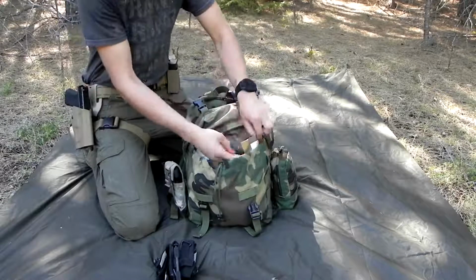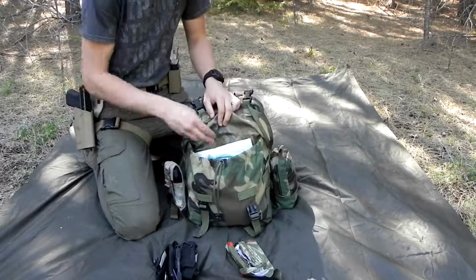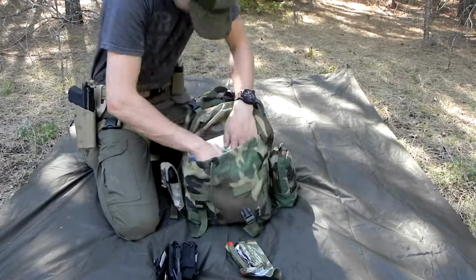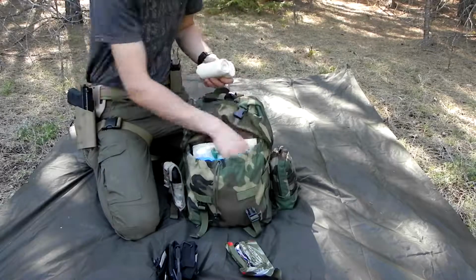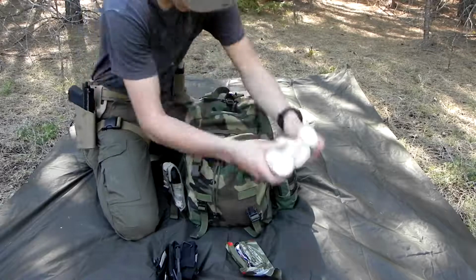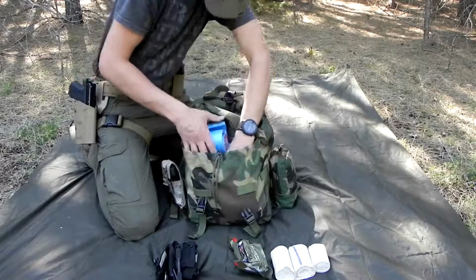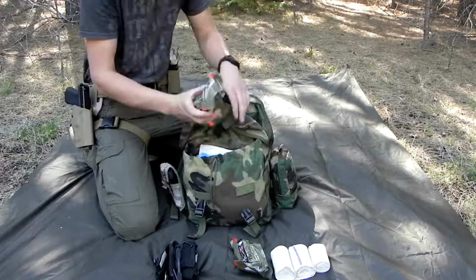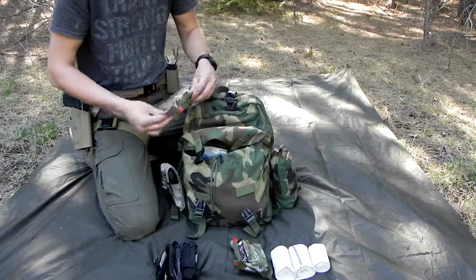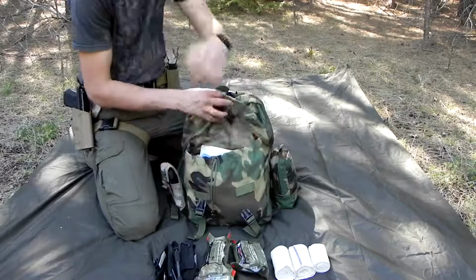and then I have trauma dressing. I got a 4-inch emergency trauma dressing, and then I have this stuff on top of that. That's a quick grab item there, and then I have three elastic bandages on top of that, and then I have a 6-inch trauma dressing, North American Rescue. Most of my equipment is North American Rescue.